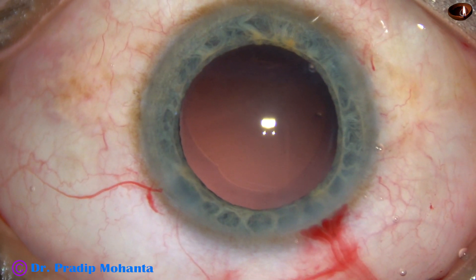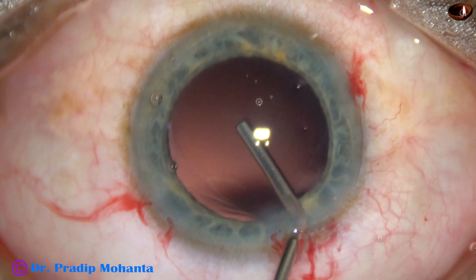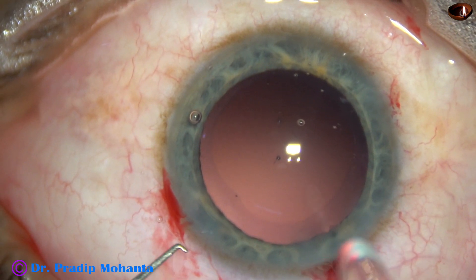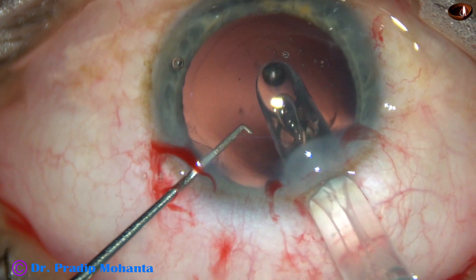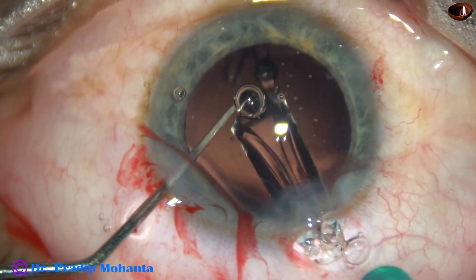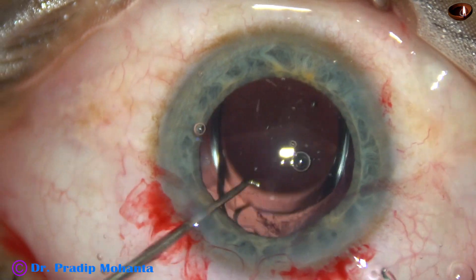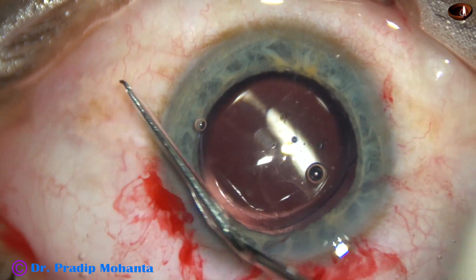And now, in this case, viscoelastic is being used for implantation of the intraocular lens. HPMC fills the capsular bag and fills up the anterior chamber. And now, a hydrophobic, single-piece, monofocal intraocular lens from Johnson and Johnson — this is Sensor 1 — is being implanted in the capsular bag. The leading haptic goes into the capsular bag, but the trailing haptic remains at the main incision. A Sinsky hook is used to push it into the anterior chamber, and then the chopper depresses the haptic-optic junction, and the lens goes into the capsular bag. The lens is dialed to place the haptics at 2 o'clock and 8 o'clock positions.